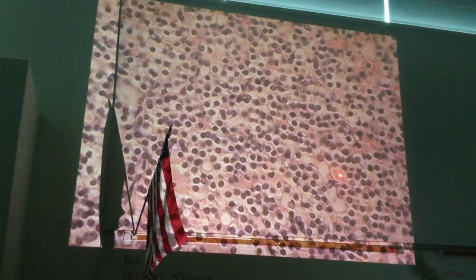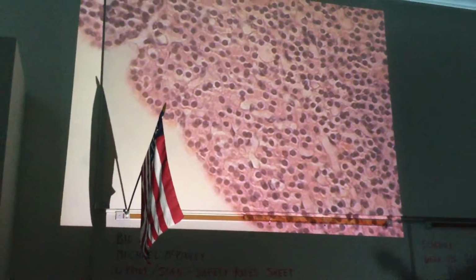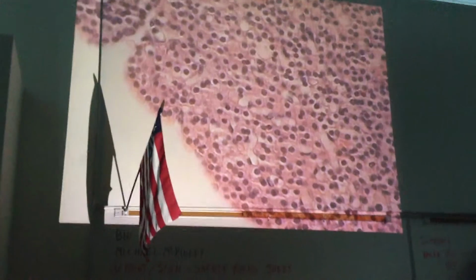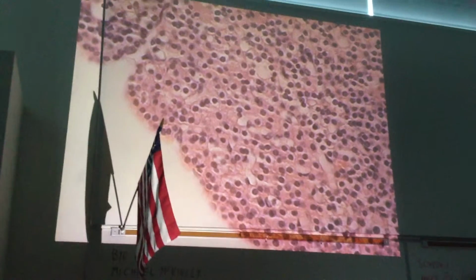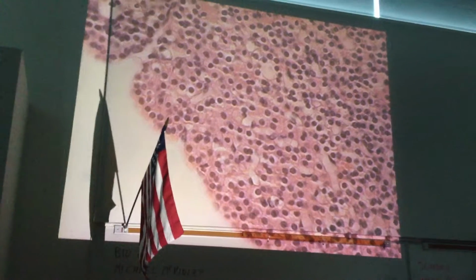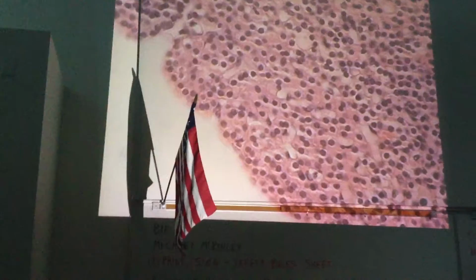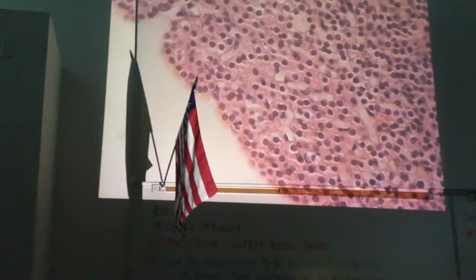Here, this is a blood vessel. Now let's come down, and we have a whole... I've looked through here, and I found a whole nest of cells that have a large nucleus, but they have pink cytoplasm. Those are called oxyphils. It's unknown what they do. So pink is kind of the distinguishing feature here. Pink for the hemoglobin of the red blood cells. But if you have pink cytoplasm, you are an oxyphil. If you have clear cytoplasm, you are a chief cell, and you make a hormone.